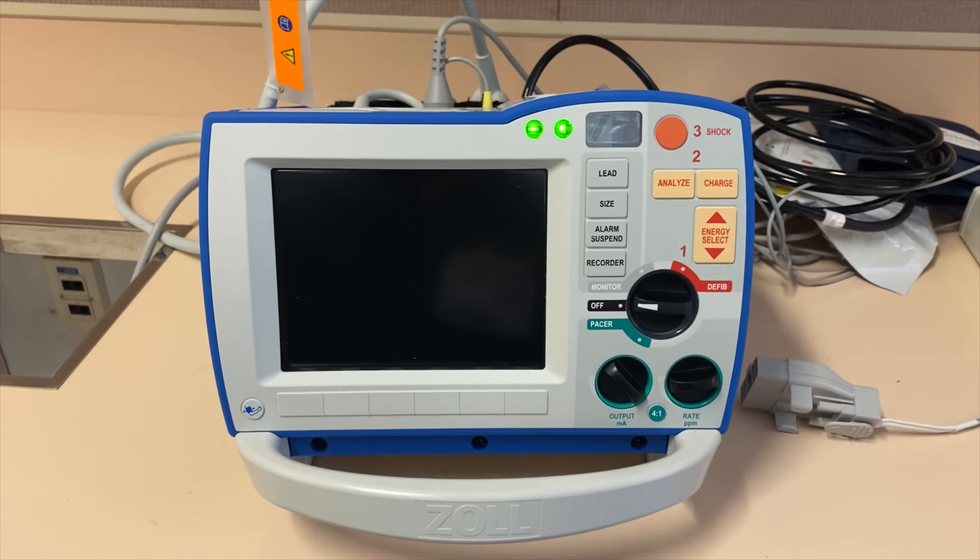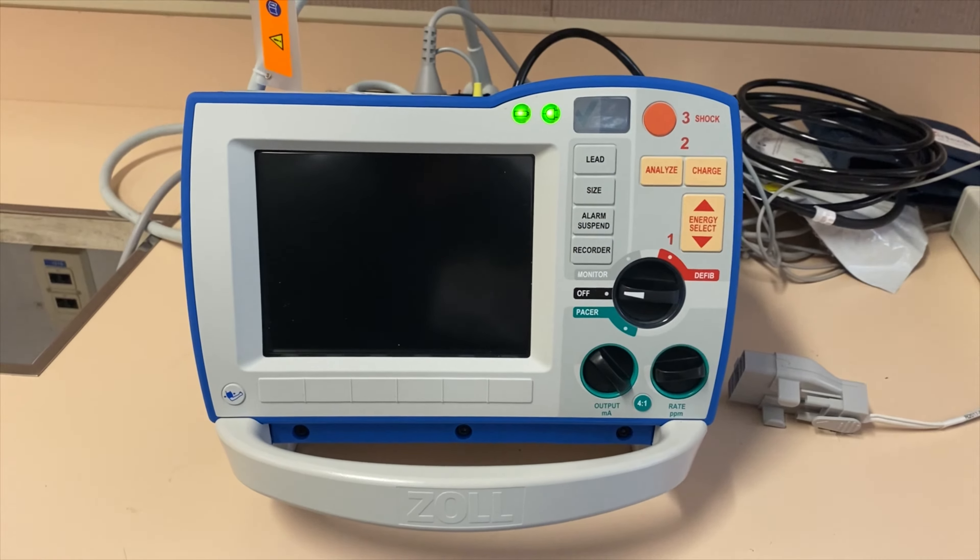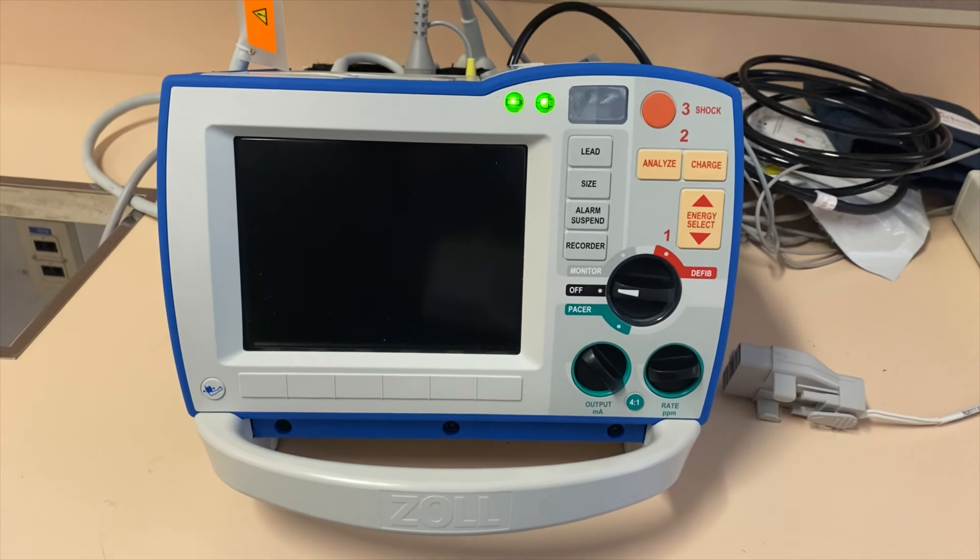Hello everyone. So for today we are going to learn how to use a Zoll defibrillator. Welcome to another learning with I am Dennis P. So today we are going to talk about the Zoll defibrillators.